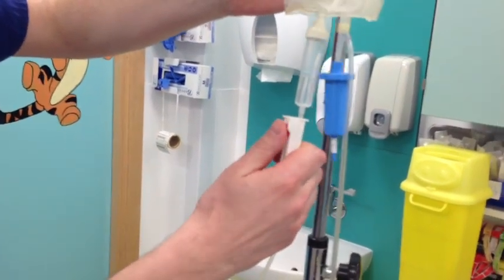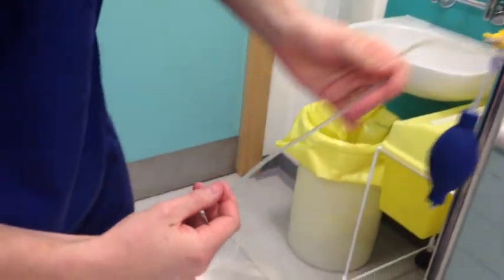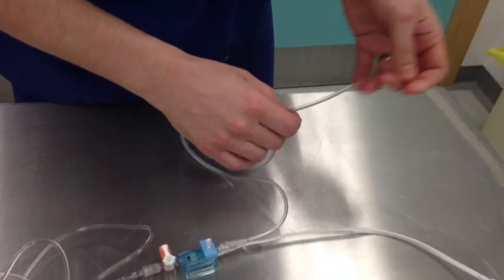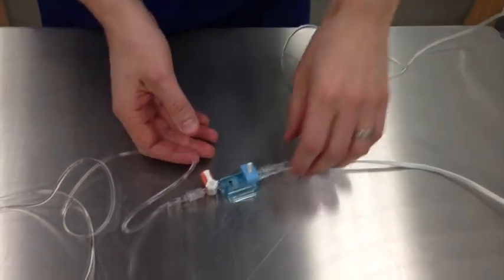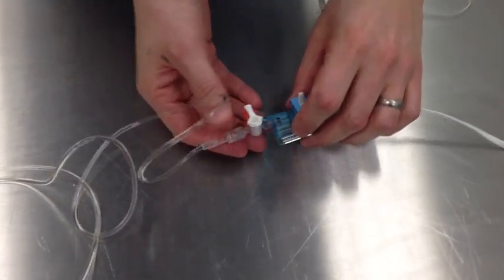The stop cock is open, following the tubing down to the pressure transducer. There are no air bubbles and the tubing is intact, following all the way down to the pressure transducer itself, which is off to air and open to patient.